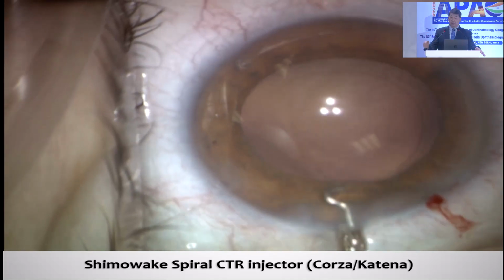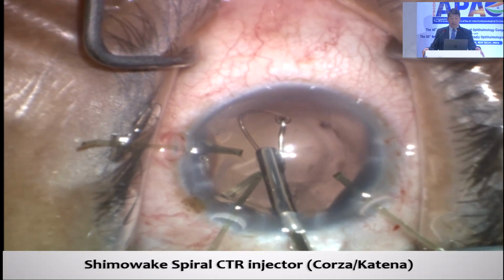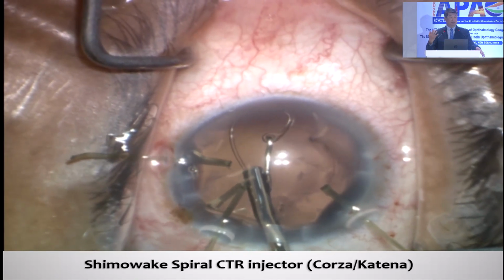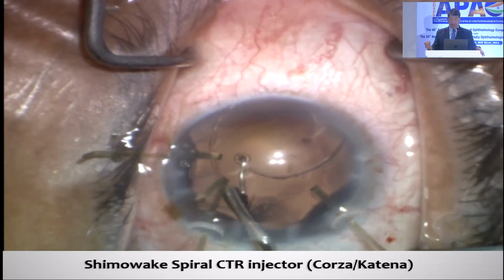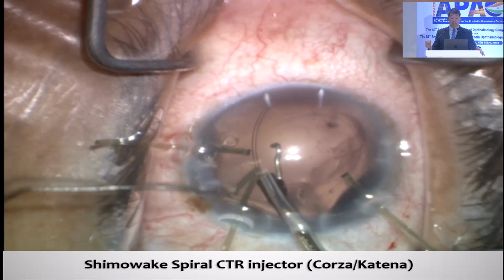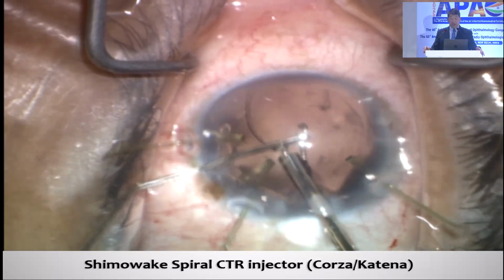And this is what I now use for my CTR injector. I showed you we had the capsule retractors here, and sometimes this will get tangled up in the capsule retractors, but look how nicely this spiral CTR injector does. It's available through Catena Corsa, it's reusable, and I use this. Sometimes it doesn't come off, no problem, you just knock it loose.